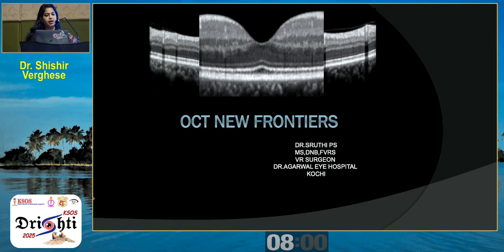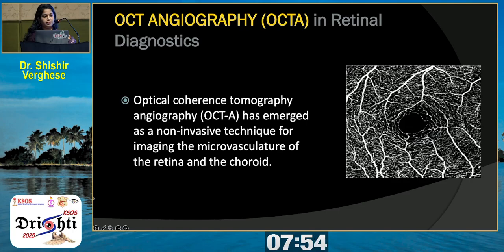We already learned about OCT in detail. So I am going to talk about what next, what are the available advancements in OCT. The first one is OCTA. Sir already discussed OCTA in detail, so I am not going to go into detail about it.